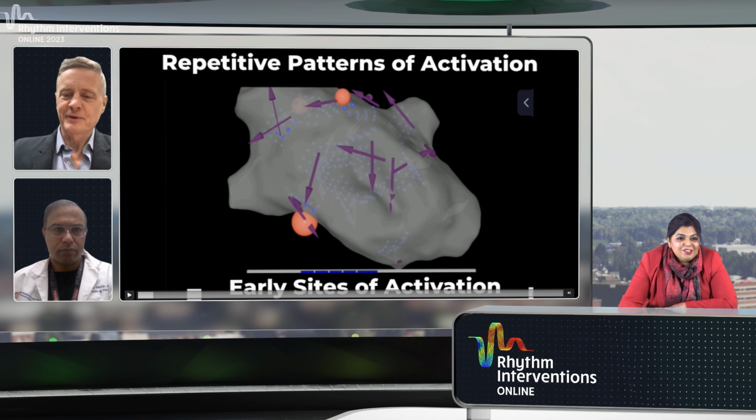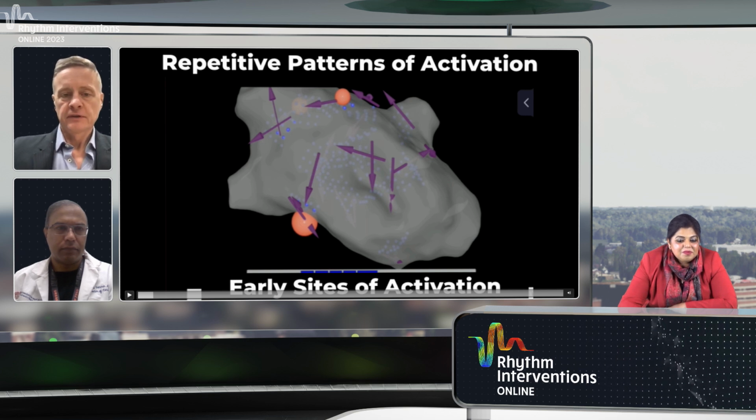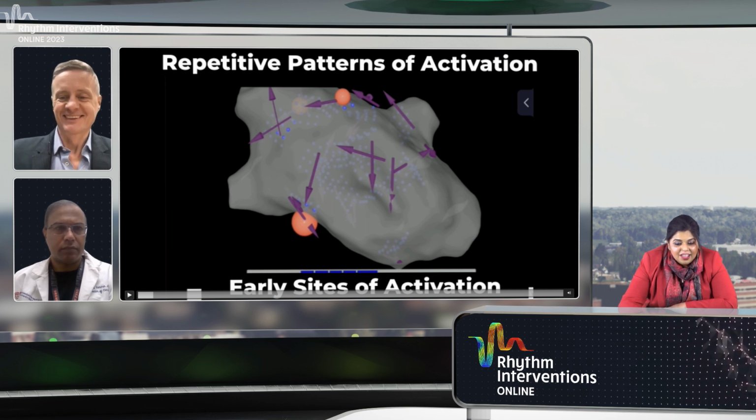It's a great question. Or am I in trouble? I paid you to ask that question because we have an FDA submission in to take the data directly from an Ethernet cable live from Insight. So the map will update itself as we go along. What will happen in the future is that you'll be able to decide which direction you move your grid based on the RPAs and what they're pointing to. So it'll be live in Q2 next year. Checks in the post. That's great.